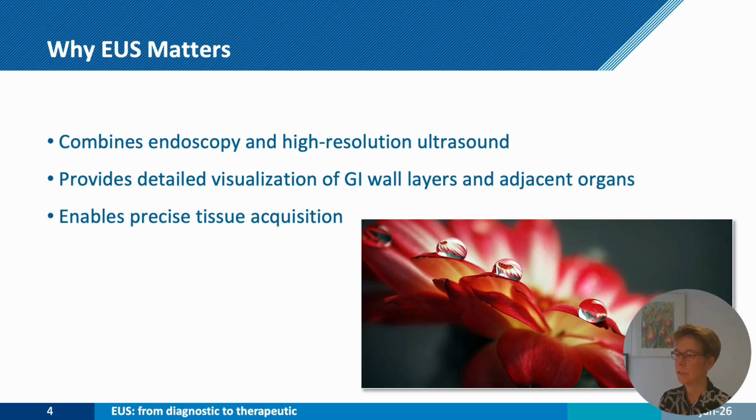Why EUS matters? EUS combines endoscopic and high-resolution ultrasound. It provides detailed visualization of the gastrointestinal wall layers and adjacent organs, and it enables precise tissue acquisition.